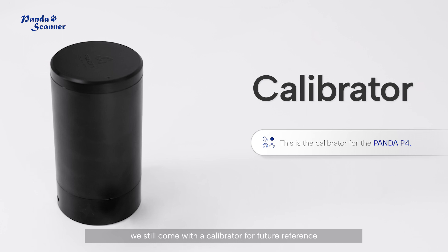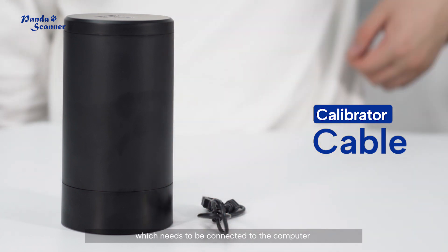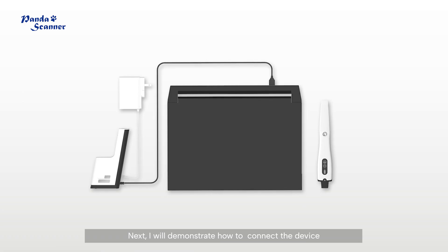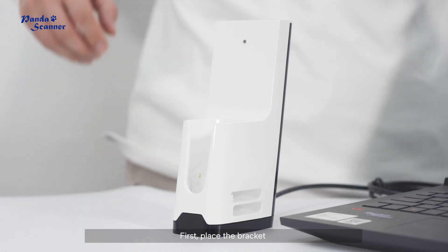Although our product is calibration free, we still come with a calibrator for future reference. This is the cable for the calibrator, which needs to be connected to the computer. Finally, a USB drive that contains necessary files.